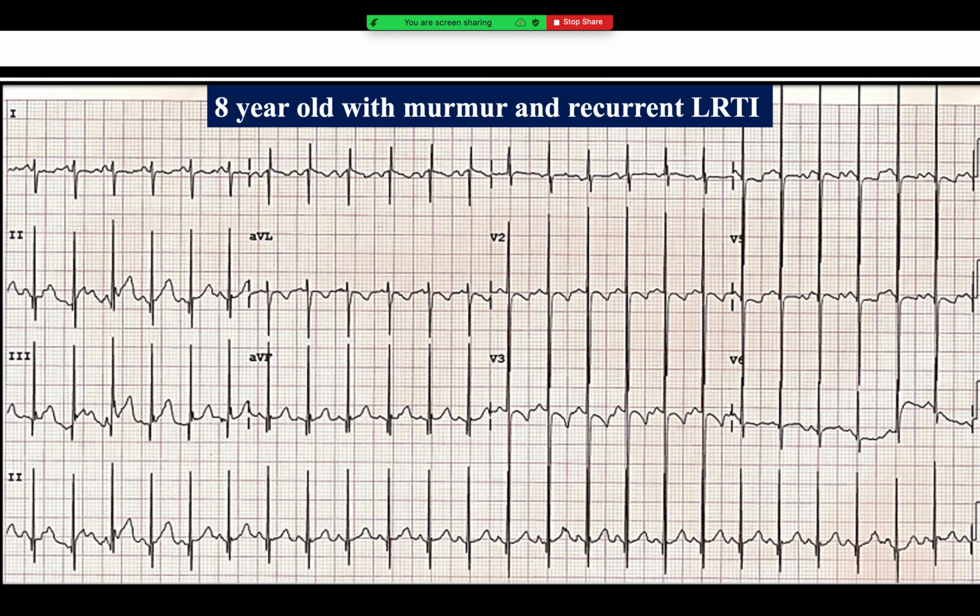Isn't it? It is sinus tachycardia. We can see the P waves in front of all of those complexes. Axis wise, right axis deviation. How are these P waves? Because the patient is in tachycardia, it can be a little bit difficult to say, but right atrial enlargement is there. Then, by looking at the V1, there is right ventricular hypertrophy, right? Then we look at the V5, V6. What does it further say? LV volume overload.